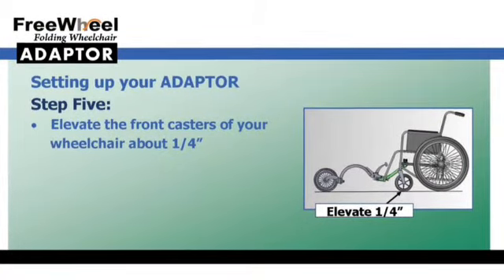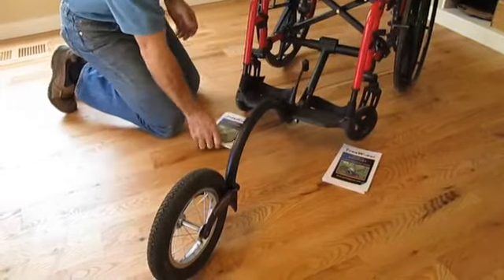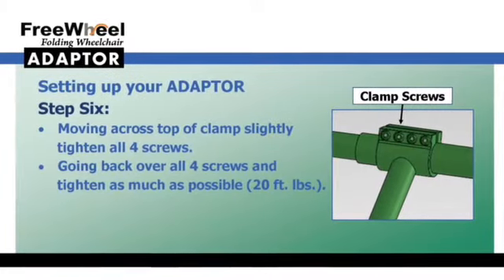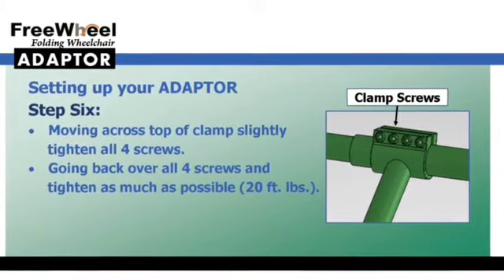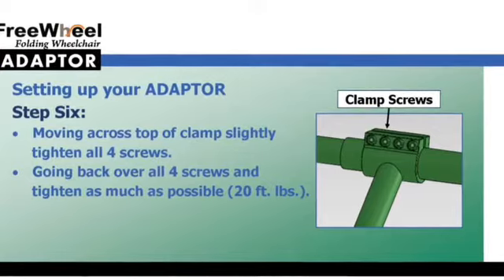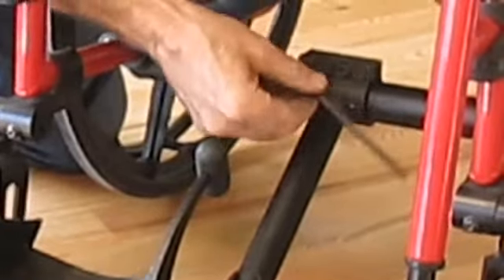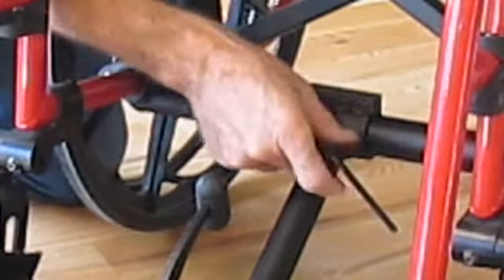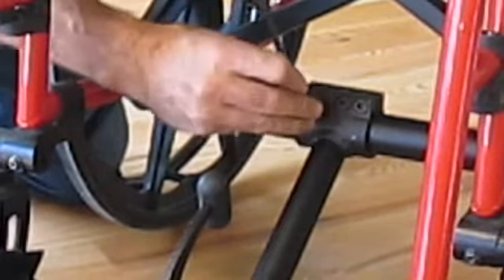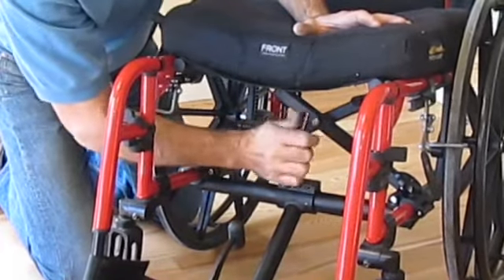We have found that if you slightly elevate the front casters of your wheelchair about a quarter inch prior to this next step, you do not need to adjust the angle of the FreeWheel. This final step secures the hitch at the correct angle so your FreeWheel works properly. Using the Allen wrench, start by slightly tightening all four screws across the top of the clamp. Avoid completely tightening just one screw at a time — tighten them all a little at a time. Tighten all four screws as tightly as you can. For you engineers out there, we suggest 20 foot-pounds torque.